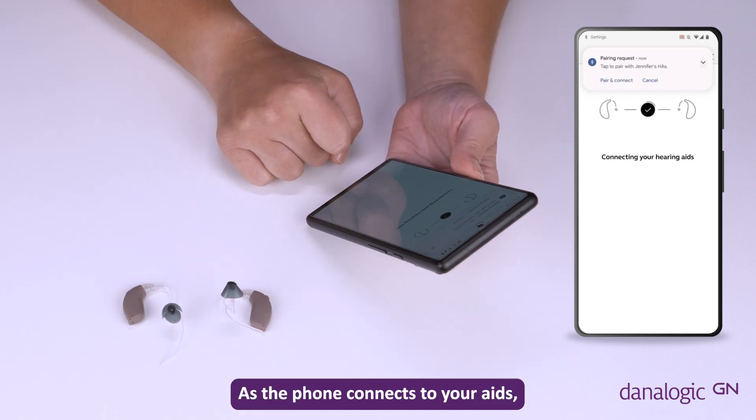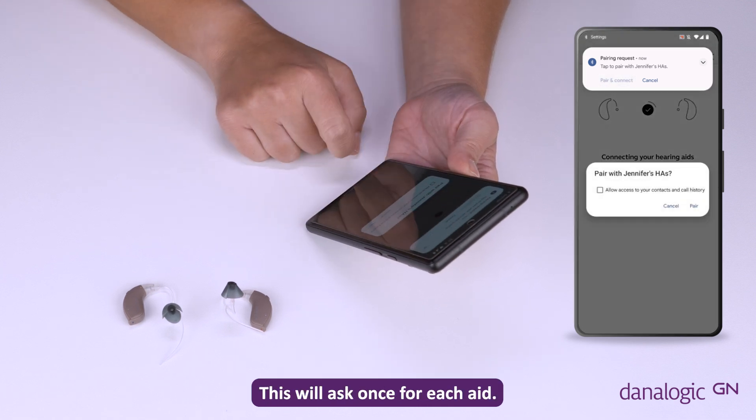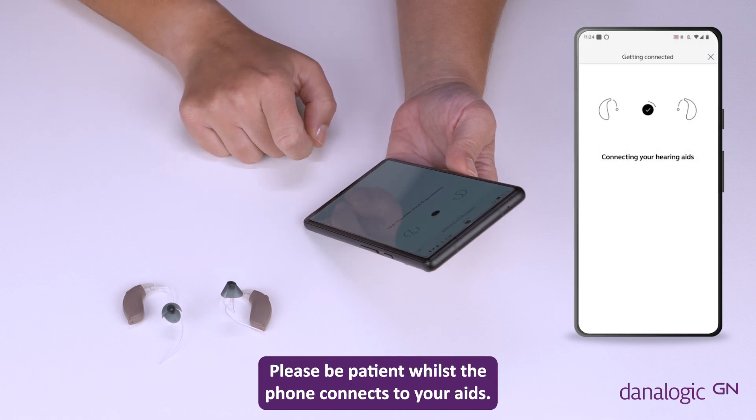As the phone connects to your aids, a dropdown will appear confirming that you wish to pair and connect. This will ask once for each aid. Please be patient whilst the phone connects to your aids.